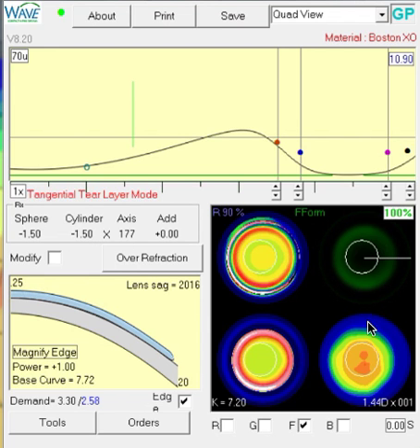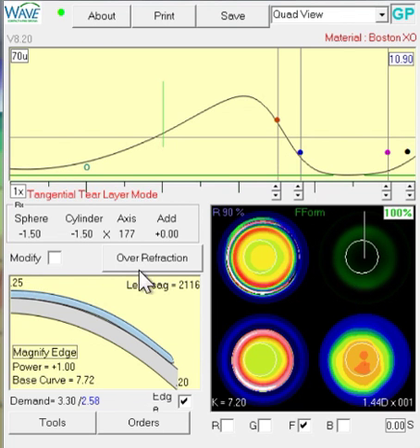There are two things we can do. One is to go to an oval optic zone and to build in a little bit more topo demand in the vertical meridian, since this is with-the-rule astigmatism. The second is to just build in the extra topo demand in the vertical meridian and leave the optic zone spherical.